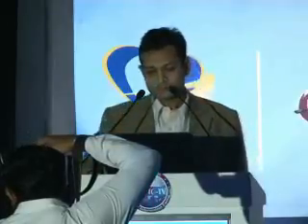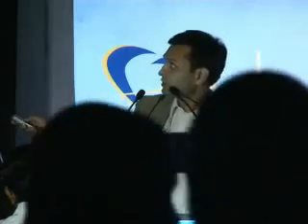Now let's take up one or two examples to see why we need to follow up after stenting. Look at this guy who had a thoracic aortic stent, a young male with a road traffic accident who had a pseudoaneurysm after rupture. We put in a stent and did a CT angiogram before discharge. You can see the graft is not properly placed here, in the thoracic aorta, and there is a potential for endoleak. So he was rightly followed up.